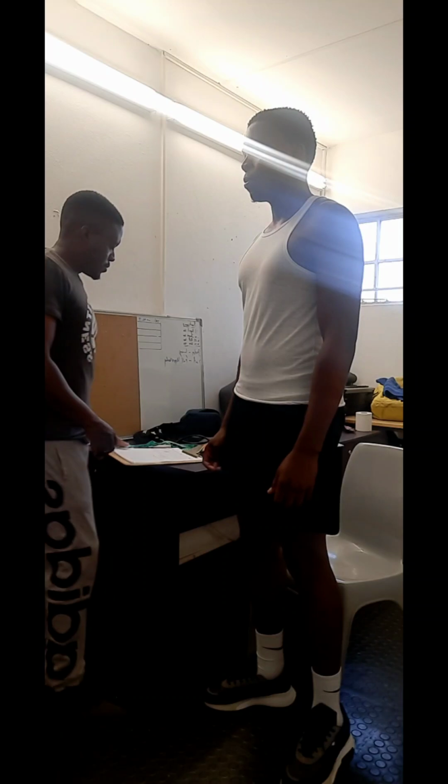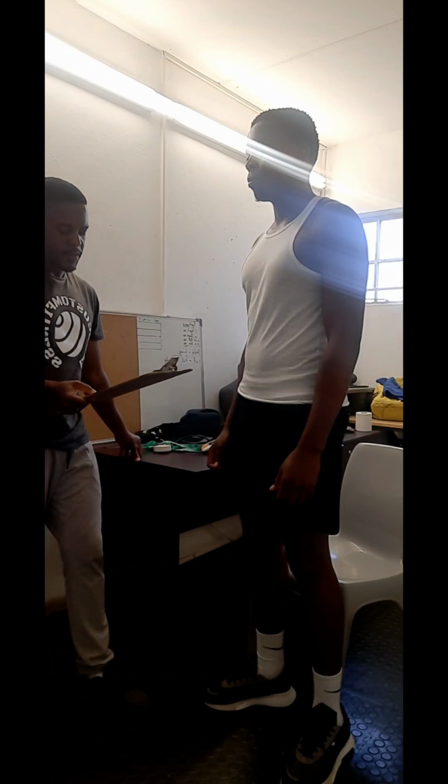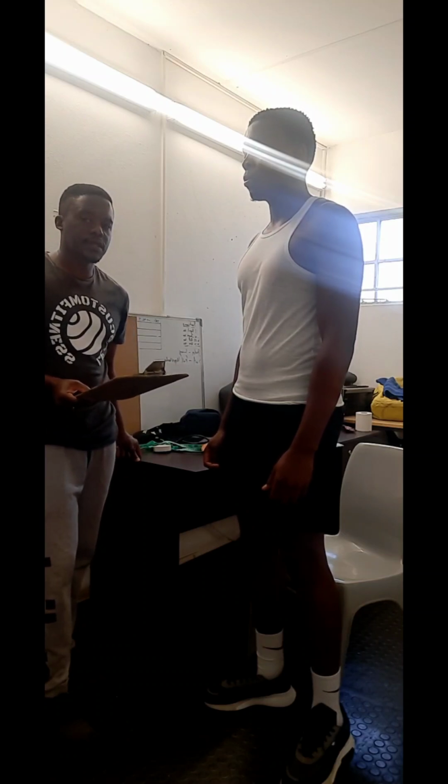We are now going to move to my client's body fat using the threefold method, where we're going to be measuring his tricep, his abdomen, and his thigh, and we are going to enter this into a formula to work out how much his body fat percentage is.